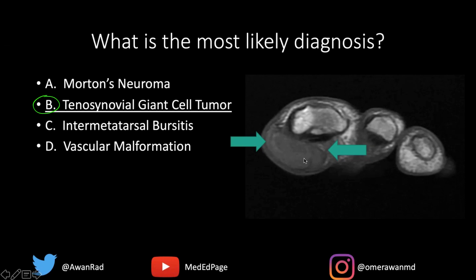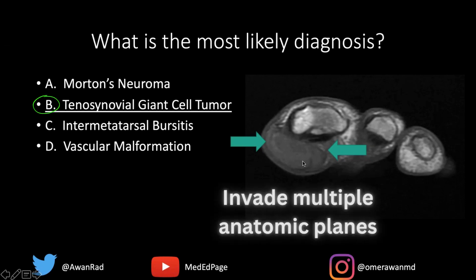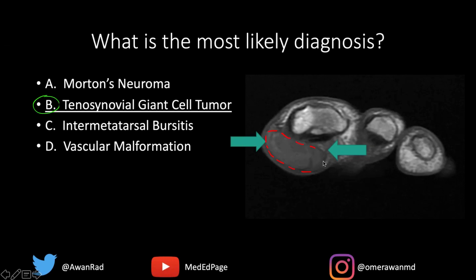Also, vascular malformations can invade different anatomic planes. This lesion is very well-defined and confined to a specific space, making a vascular malformation such as a hemangioma less likely.